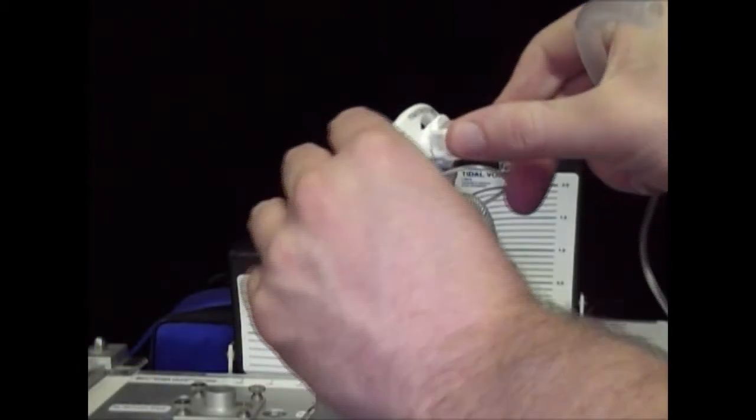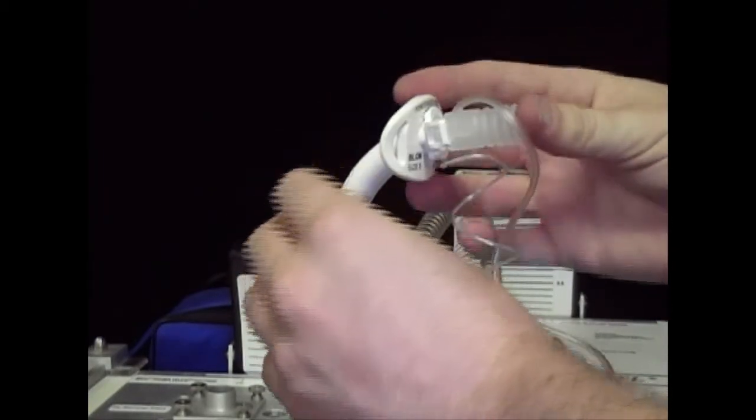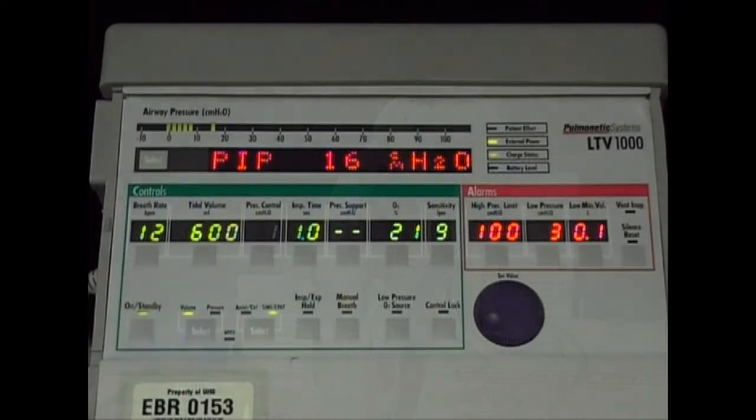Insertion of the subglottic suctioning cannula. You will now hear an audible click indicating the cannula is now secured to the Blom outer cannula. Now we are using the Blom subglottic suctioning inner cannula. Our ventilator settings are the same, SIMV of 12, tidal volume of 600, PEEP of 5. As you can see, our peak inspiratory pressure remains the same at 16.